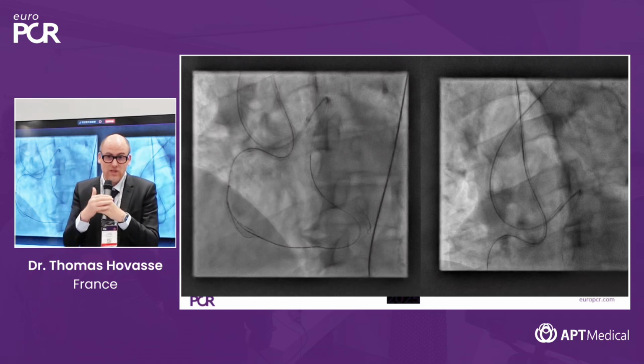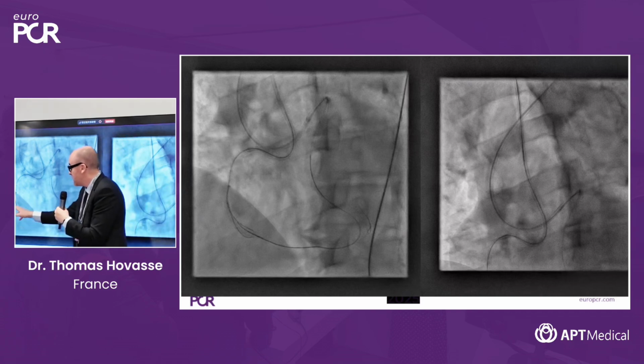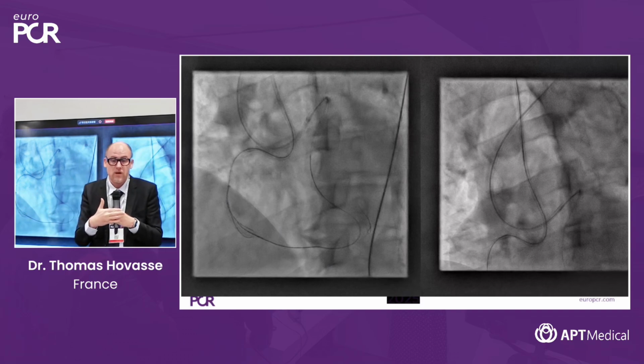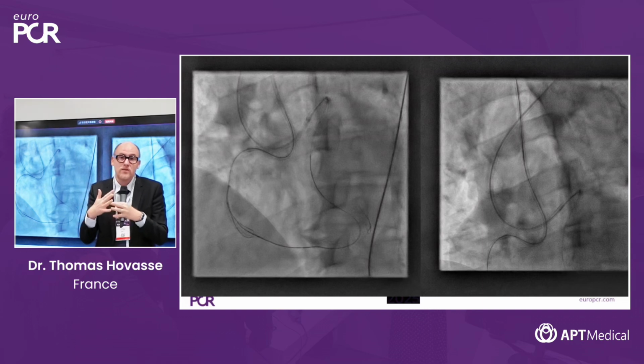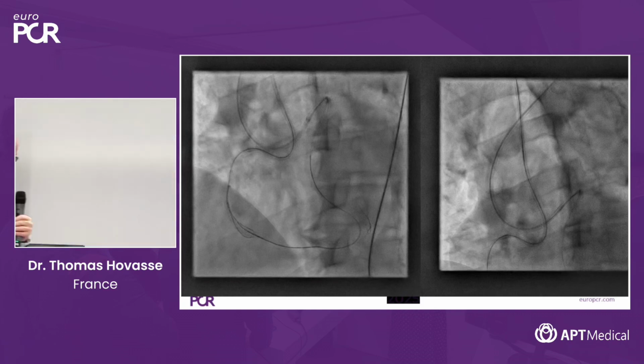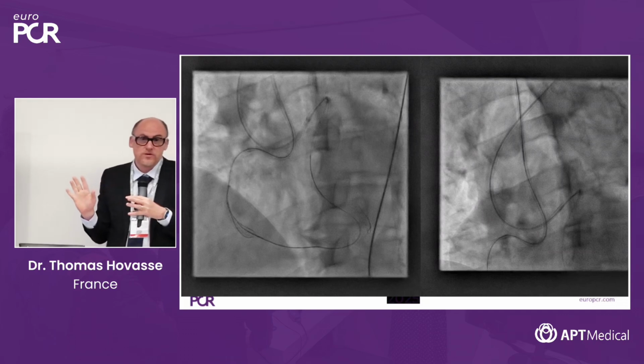So to perform a good reverse CART, when the two wires are in place here, they are dancing, and you are confident they are in the architecture of the vessel, you have to take a balloon at the size of the vessel if you want the reverse CART to be effective. So at least a 3.0 balloon in this case. That's very important. Don't be shy with the balloon for the reverse CART. The smaller the balloon, the more difficult the reverse CART.